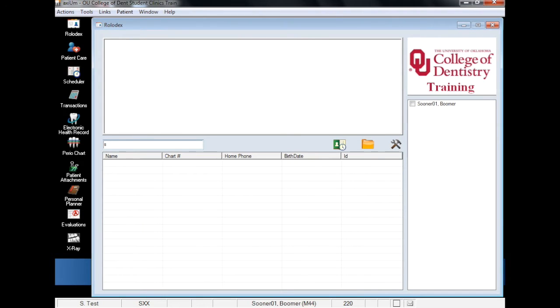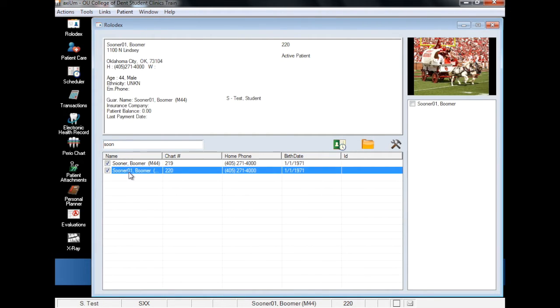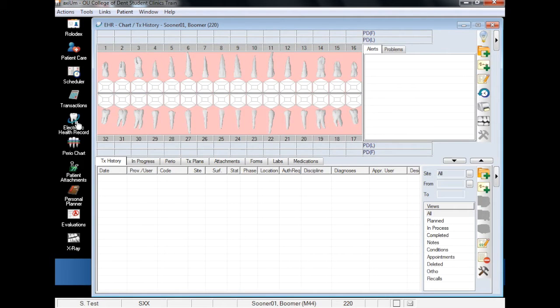The first step when charting findings is to find your patient in the Rolodex and navigate to their EHR module. Opening the EHR will take you to your patient's odontogram.